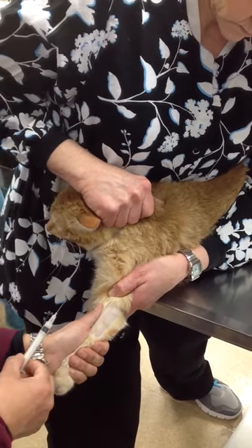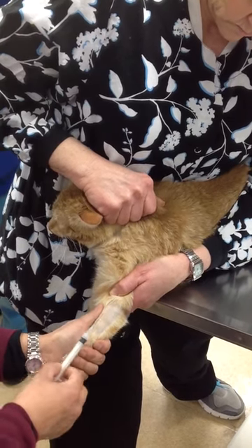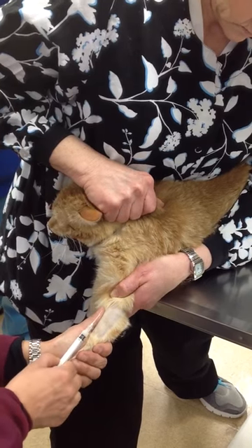I'm going to lay my thumb alongside the vessel, but I'm not going to stretch it because it will collapse the vessel. I'm going to take the needle and syringe and lay it right on the palm of my hand here.